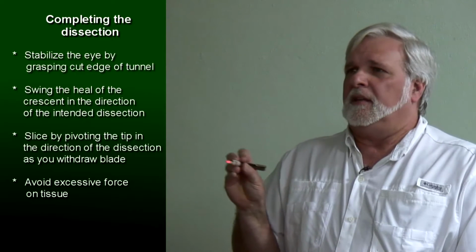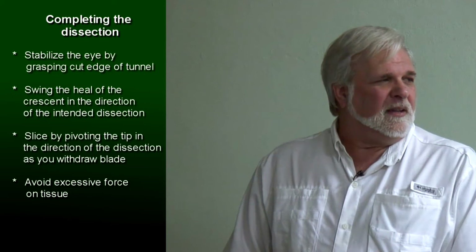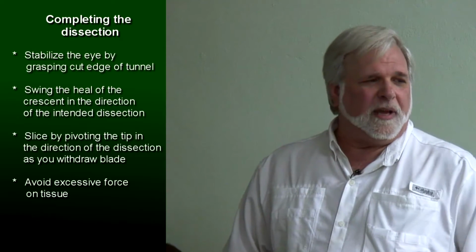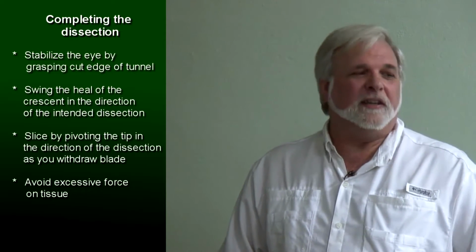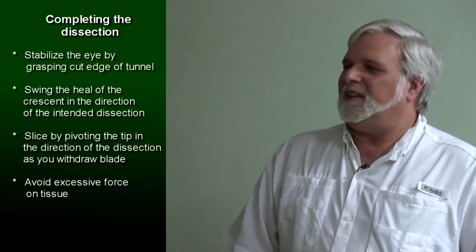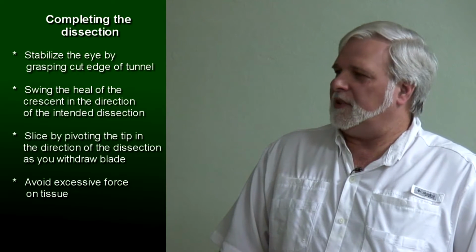So you stabilize the eye by grasping the cut edge of the tunnel. There are those that would gasp at that: you never grab a cut part of the eye, you never do that. But Dave just made a big point about making a good thick scleral groove edge. I don't know if he grabs that edge or he does grab that. Okay, I wondered if you did when you said that. Because I tell you, there is no better way to stabilize the eye, and the most extreme forces on the eye occur during the tunnel dissection.